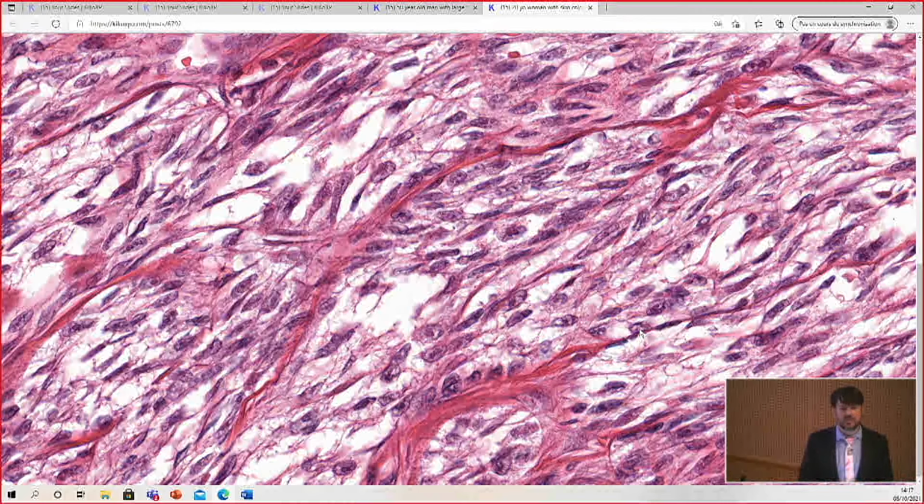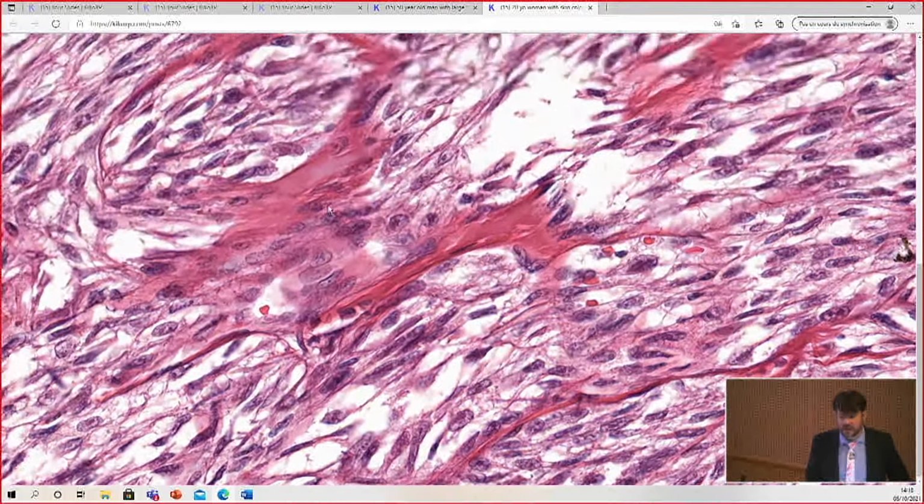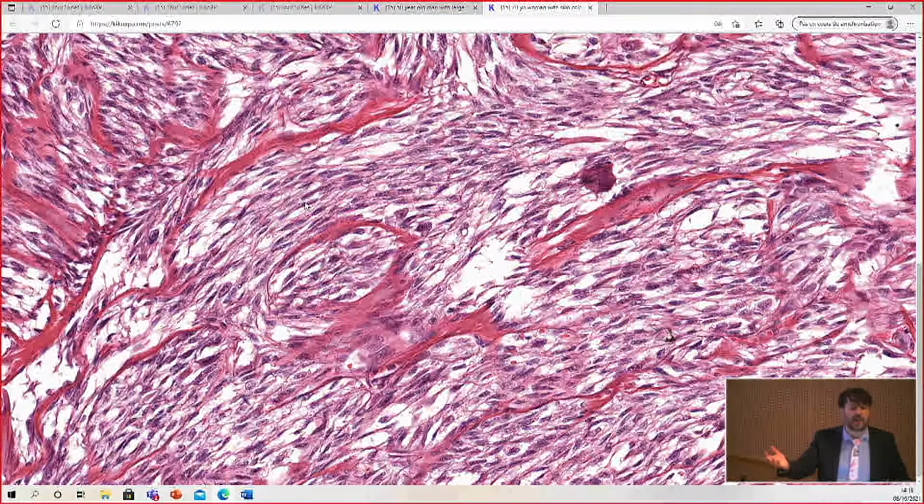Pleomorphism oftentimes is a marker of underlying chromosomal instability or aneuploidy, random chromosomal gains and losses. This is not a perfect rule, but it works pretty well, because if you think about all of the translocation sarcomas, synovial sarcoma, Ewing sarcoma, clear cell sarcoma, which is what we have here, and more, they may have mitoses or necrosis, but you don't usually see pleomorphism. Now this tumor, when it recurs or metastasizes, can sometimes get pleomorphic, but usually it does not. And it's a really great rule. Solitary fibrous tumor is translocation associated. It's a really great pearl that one of my mentors, Dr. Mark Edgar, taught to me.